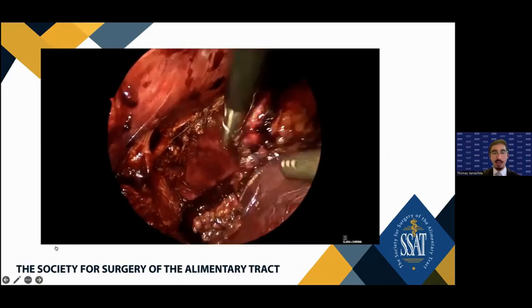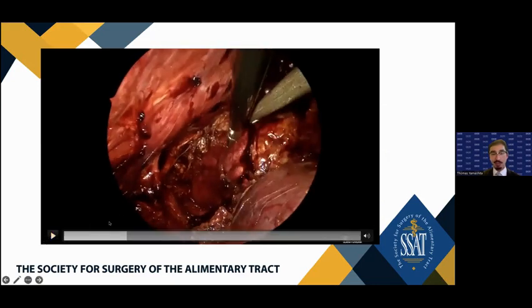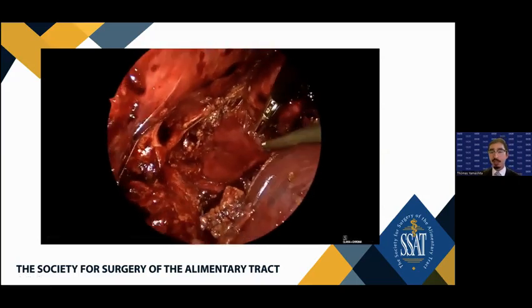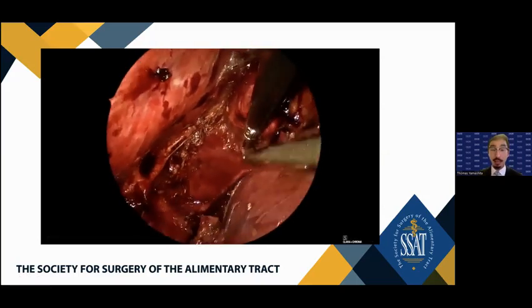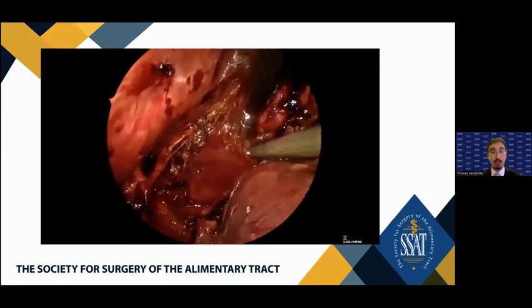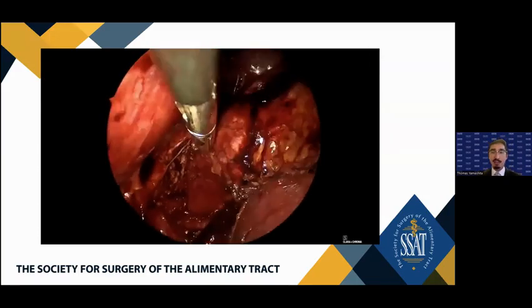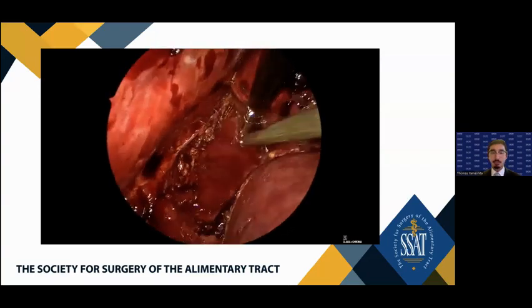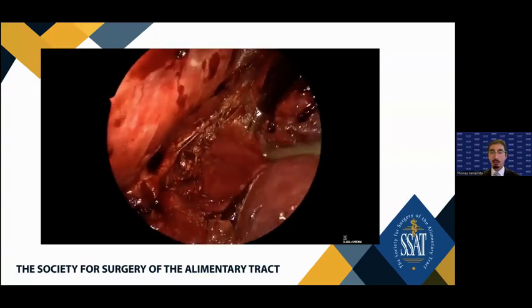So we see the IVC fully collapsed there because of the pressure. And even if you bled, it's something that's relatively easy to control at that level of pressure. So it's fully collapsed, so it's easy to mistake. I have the adrenal vein in view fully there. I'm just cleaning it up around it to get the perfect angle to then get the clip.